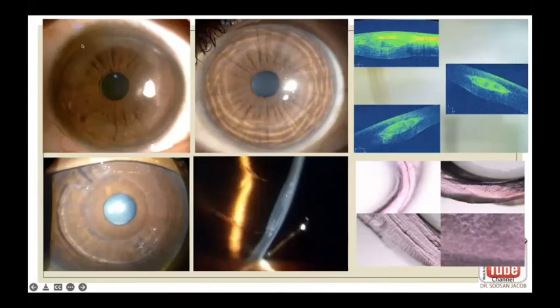Again, some more examples. These are cases where we've enlarged the optic zone and gone more peripherally. Here you've got an optic zone of probably about 6 millimeters. You can go even closer. You can have 360-degree segments implanted intrastromally, or you could have two segments implanted on either side of the incisions. This is again showing you the mid-stromal depth, the slit image.